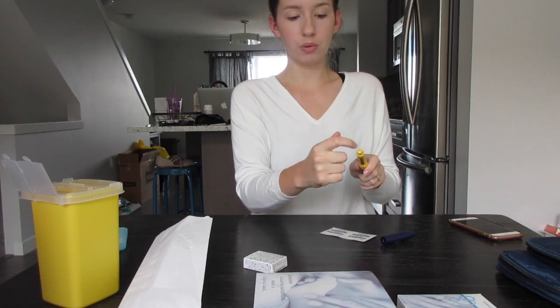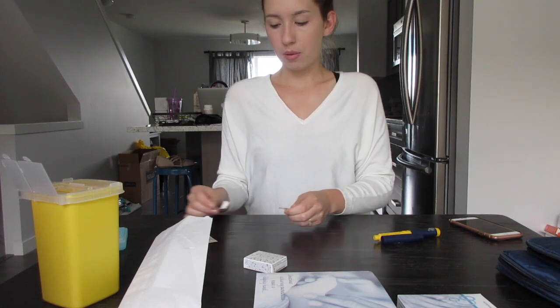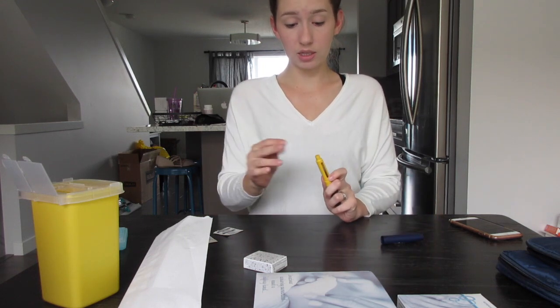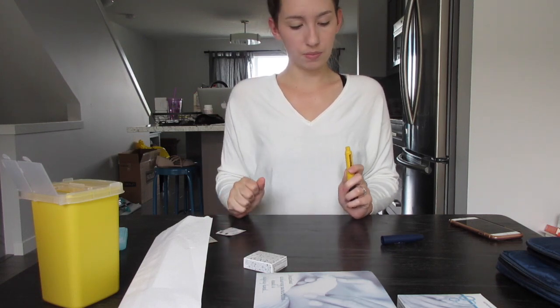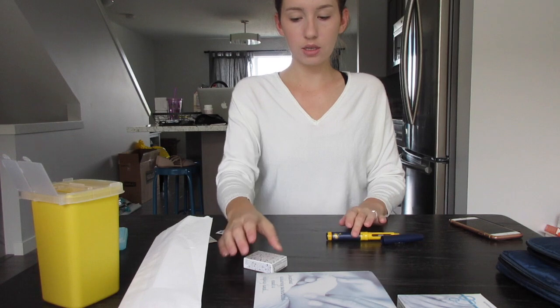At the top is where you put your needle in. This needs to be cleaned every time with an alcohol swab. Basically, the rule of thumb is if it gets poked by a needle, then it gets cleaned. So this is going to be poked by the needle, therefore it needs to be cleaned. So just a little bit of alcohol on the top and you're ready to go for that.